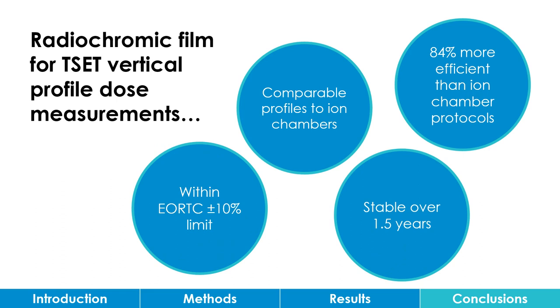In conclusion, film measured profiles were within the EORTC plus or minus 10% limit, are comparable to ion chamber measured profiles, are stable over time, and their resulting data collection protocols offer substantial time savings with an 84% more efficient protocol.